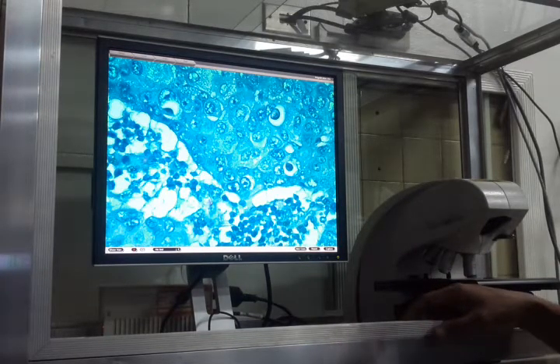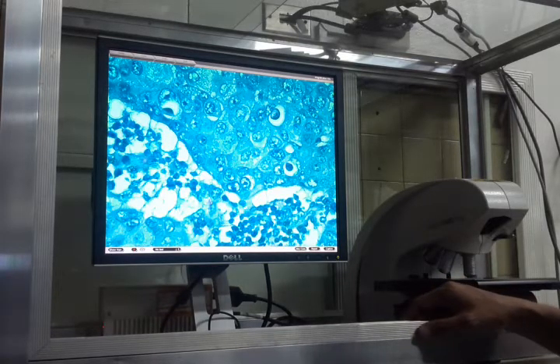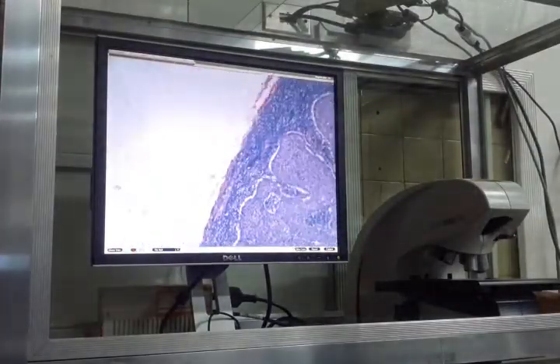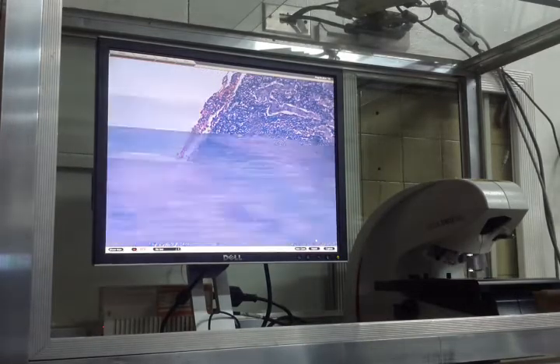Okay? For mesenchymal cells, ang maraming eosinophilic cytoplasm, lahat ng types ng muscle, eosinophilic cytoplasm. For epithelial cells, it's just the hepatocytes and the squamous cells. Intercellular bridging can be seen in squamous cells. Normally, can you see squamous cells within a lymph node? Nakakita ka ng squamous cell within a lymph node? No. Paano siya nakarating doon?